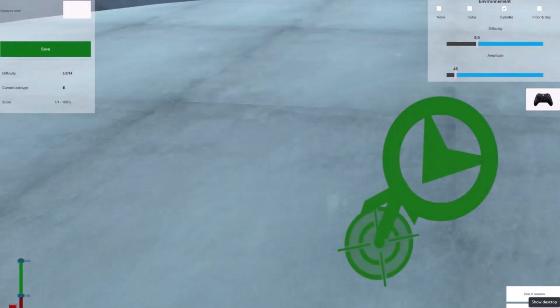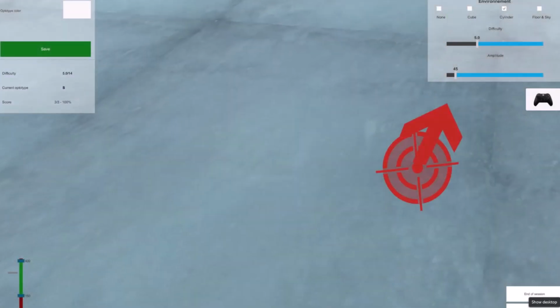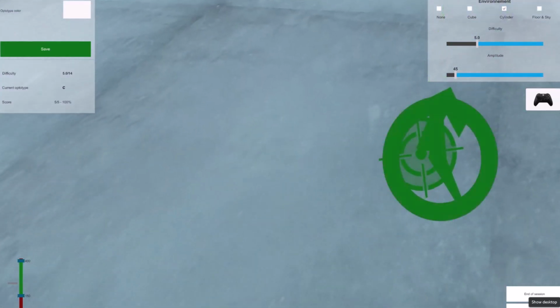Then as the patient performs the exercise, I'm getting good objective feedback on the screen. So I know, can I increase the speed a little bit more? Can I push the patient a little bit harder in clinic to make sure they're really getting that customized and optimized rehab?